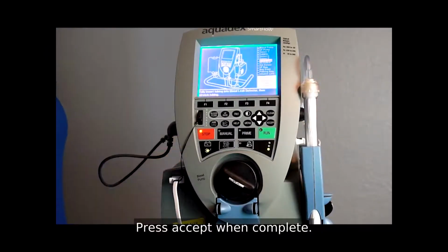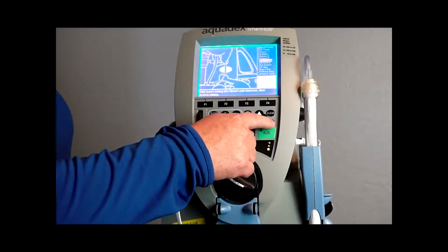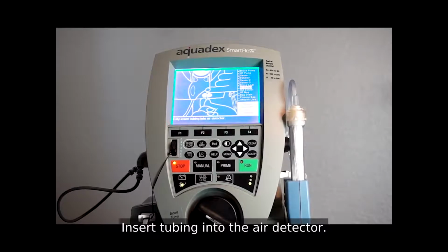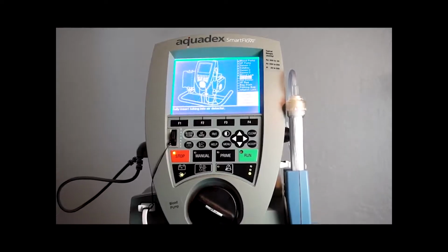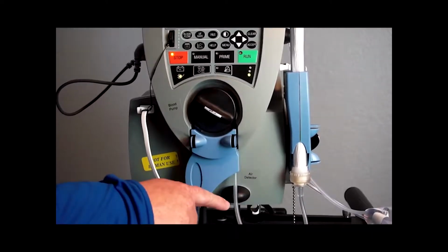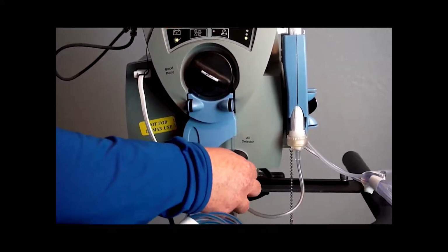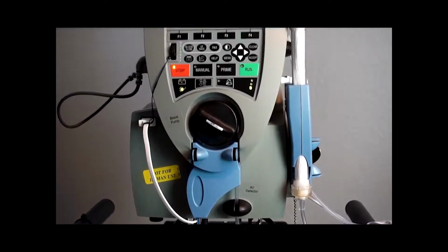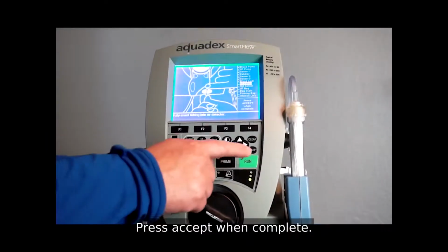Press Accept when complete. Insert tubing into the air detector. Press Accept when complete.